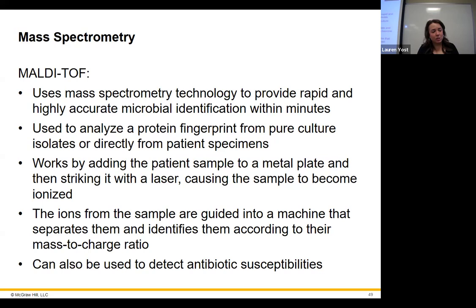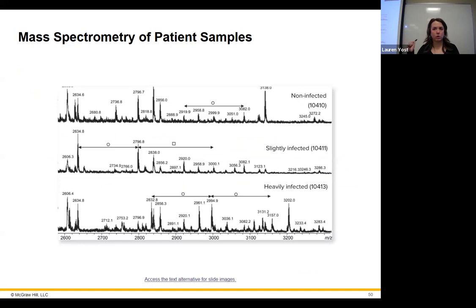I had someone in the lab that I used to work at at OU who did this, like that was their specialty. I just don't know enough about it myself. So anyways, these peaks are determined by how many molecules appeared at that mass, essentially. Based on that, it can tell you whether that person has or doesn't have an infection, how much they're infected, and all sorts of stuff. Pretty crazy.